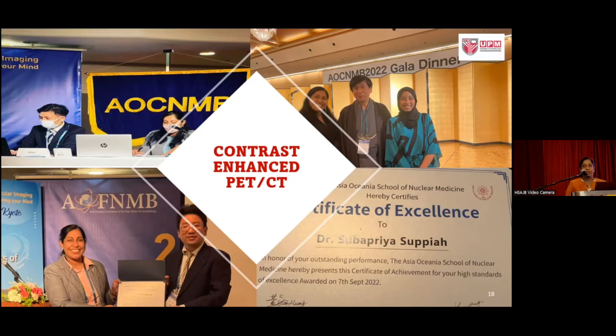Definitely, there will be some elevated SUV values when you use contrast for attenuation correction. We do not use the low-dose CT for attenuation correction, so that we can reduce the radiation dose. We just do a contrast-enhanced CT and then the PET, and do fusion attenuation correction using the contrast-enhanced CT. This enables a diagnostic scan and also a functional scan in one sitting. We have to be aware that SUV can be about 10 to 20% higher than with low dose. But this is maybe pertinent in certain conditions where the patient will benefit from contrast-enhanced PET-CT.